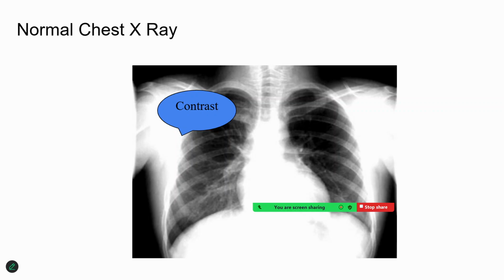Now, in the majority of the respiratory conditions, the usual view is either an AP view, anterior-posterior view, or posterior-anterior view, or a lateral view. These are the commonly preferred X-rays. For respiratory pathology, the posterior-anterior view is more preferred than the AP view. The AP view is more preferred for studying vertebral body pathologies or lesions of the posterior surface.